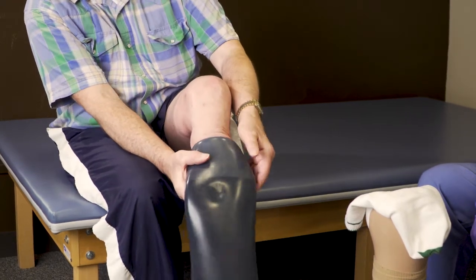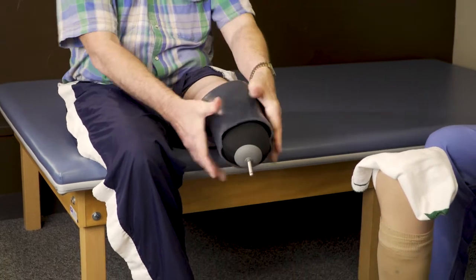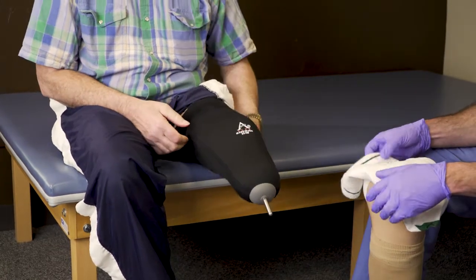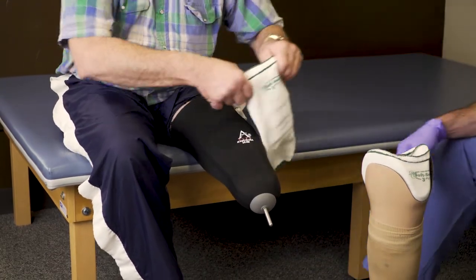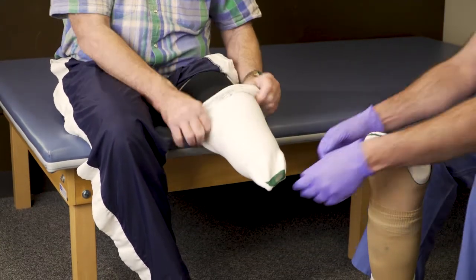So with the liner, you flatten it out all the way, right? Right. And then you just roll it on. There's no pulling or any of that stuff. No. Once it's on, it's on. Okay. And I always try making sure that the label's always up. That's important. Keep it the same way because over time it molds to your leg a little bit, so you've got the curves in that.